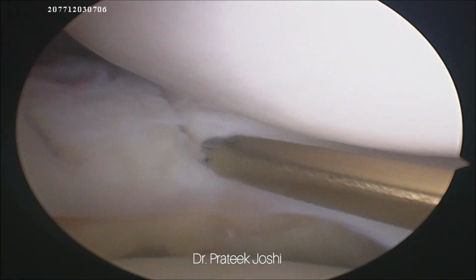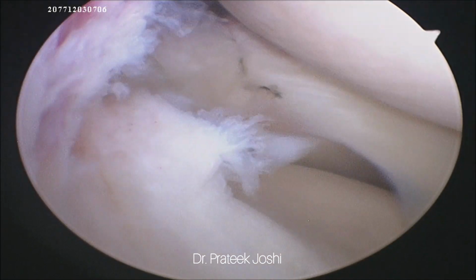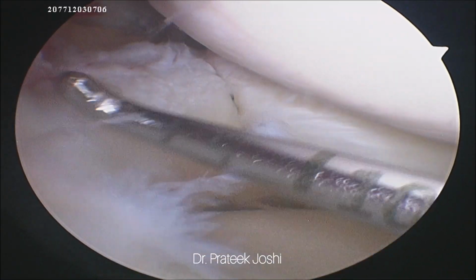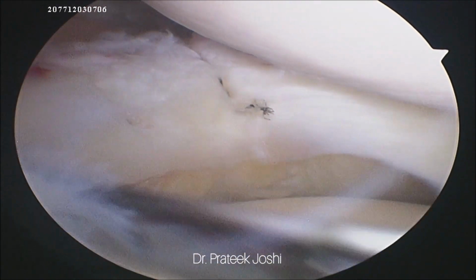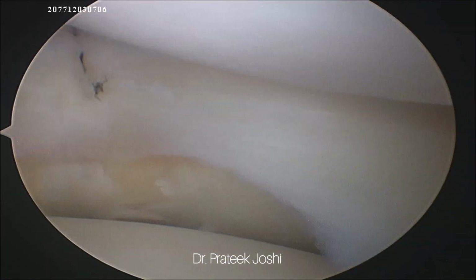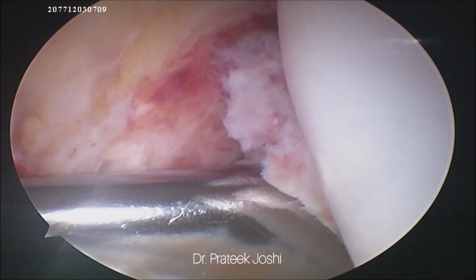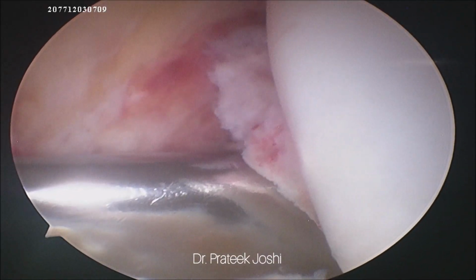You can see that the meniscus is nicely reduced and it's quite stable, and this is going to heal very nicely in this case because it's a young patient and the tear is in the red white zone. So whenever possible in a young individual, always try to preserve the meniscus when it is torn because this is going to affect joint arthritis in the long term, and we should always try to repair the meniscus in its anatomical position. So now we are shifting towards ACL reconstruction.